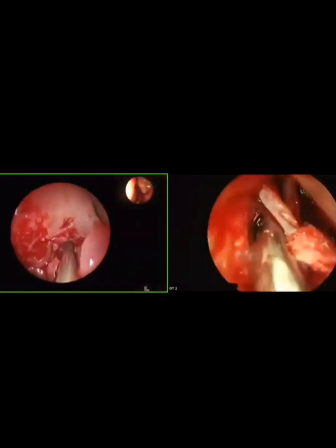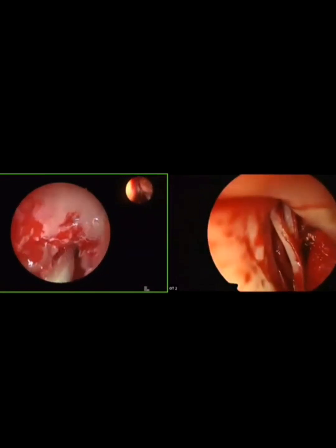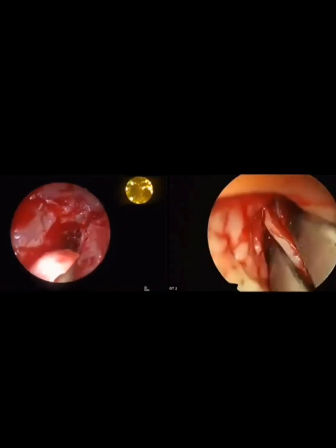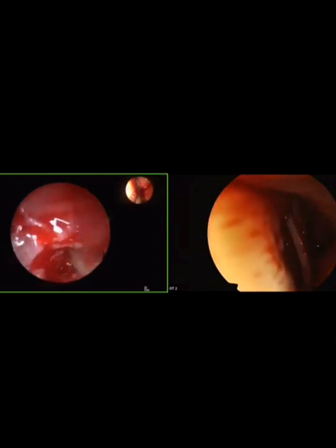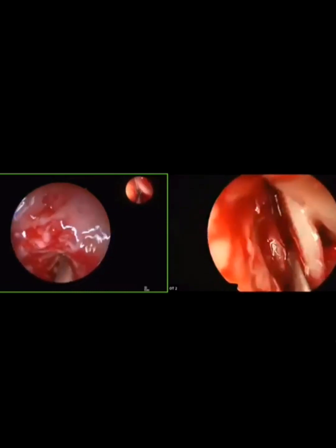For seeking the frontal sinus, the frontal recess, you have a direction. What is the direction of the instrument? The direction of the instrument is from medial to lateral. While you are seeking the frontal sinus, your direction is medial to lateral. Always the direction is medial to lateral.